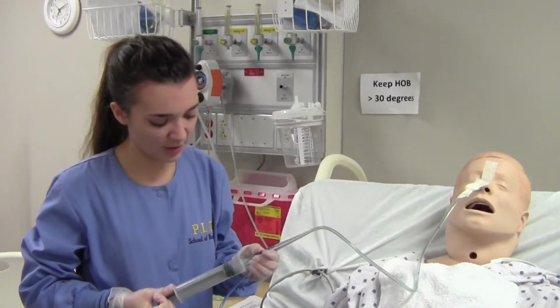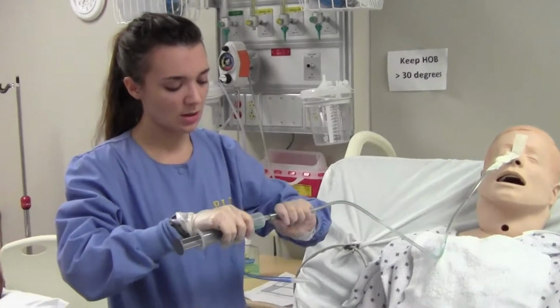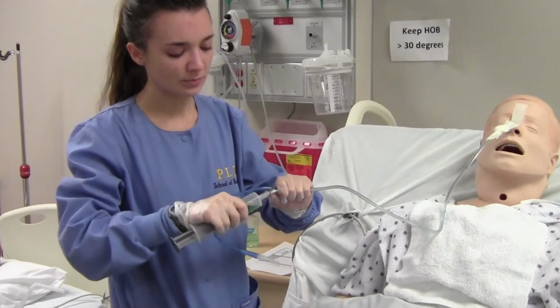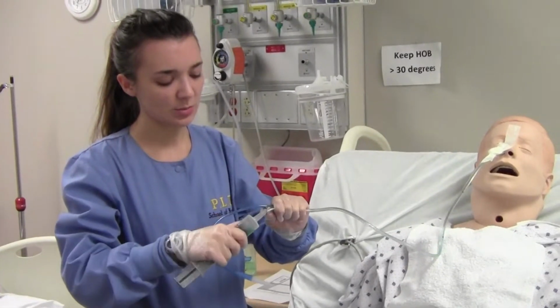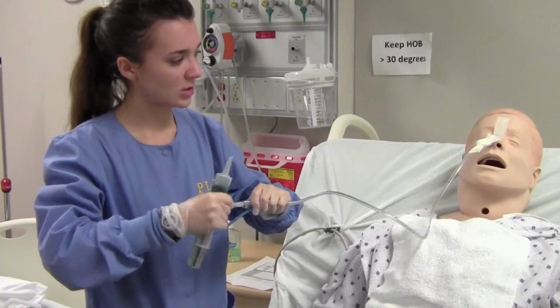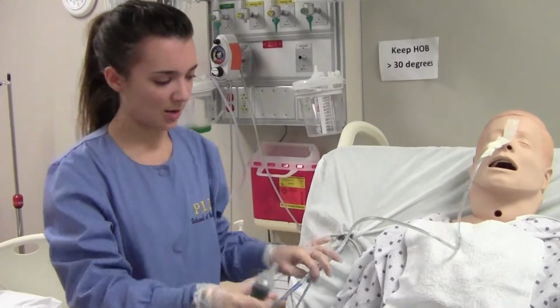And here we are. Perfect. We're in the stomach. Okay, so what we're going to do is we're going to pull this out. We're going to make sure this doesn't spill everywhere. There we go. How you feeling, Mr. Templeton? Was that so bad? Yeah, it wasn't too bad?